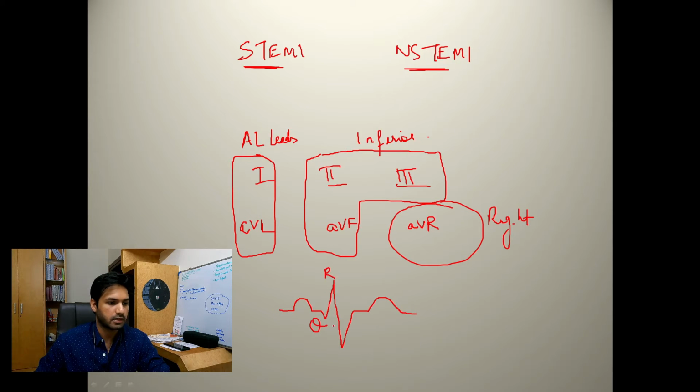This is the QRS and the T. Now this point here, when it transitioned from the S wave over to the baseline and then over to the T wave, this point over here is known as the J point. This is what you have to look at to look for changes of ST elevation or ST depression.